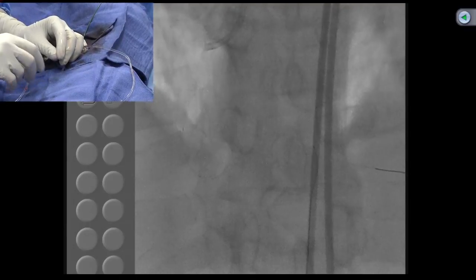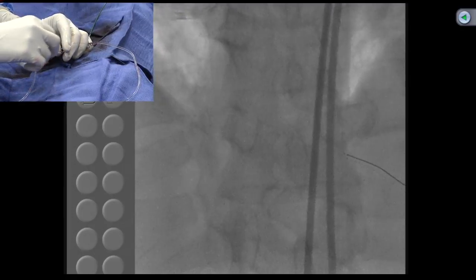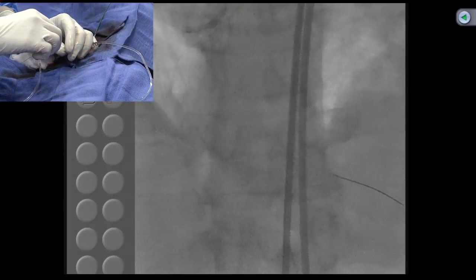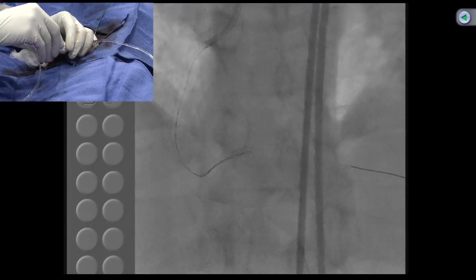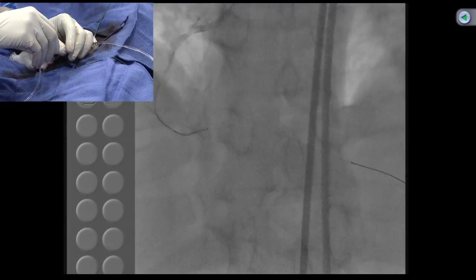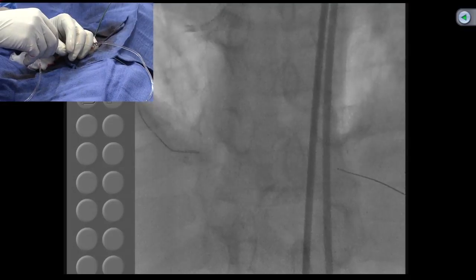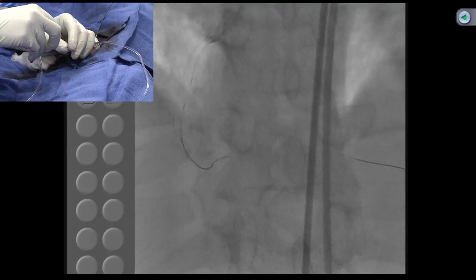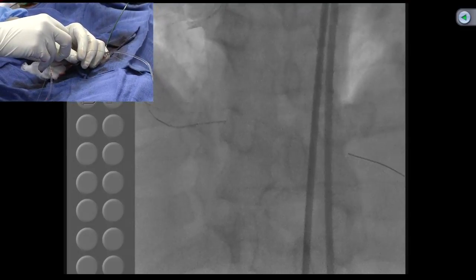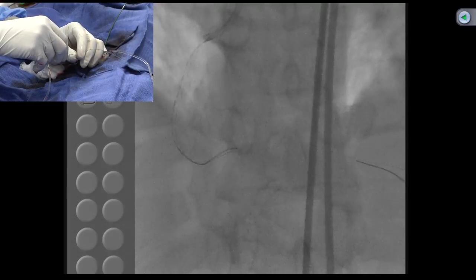Clean that balloon again. Any preference in CTOs for a DES? No, I think the trials have compared more for the BMS, although there's a trial with the EES comparing with other stents, and both were similar, so there is no true difference.